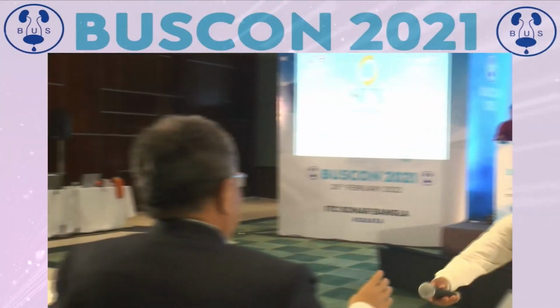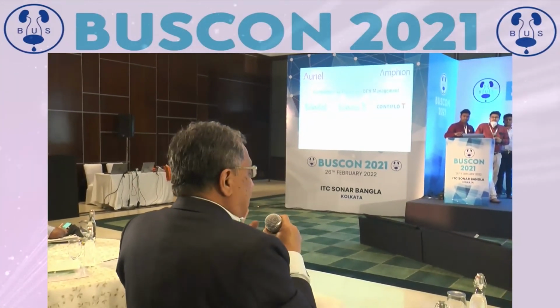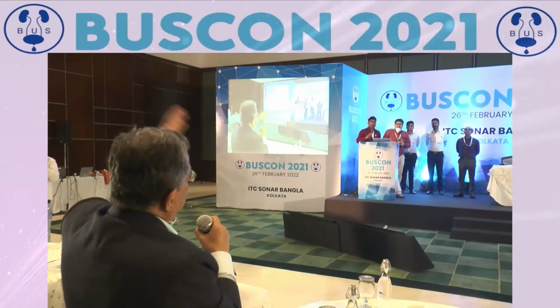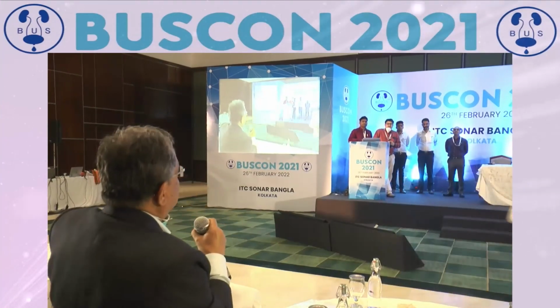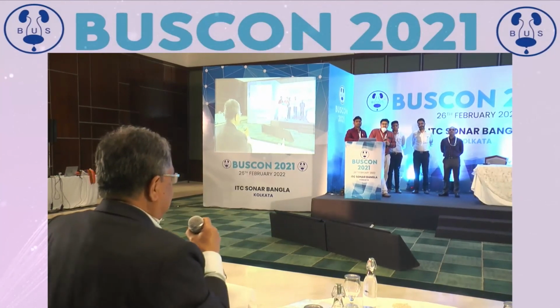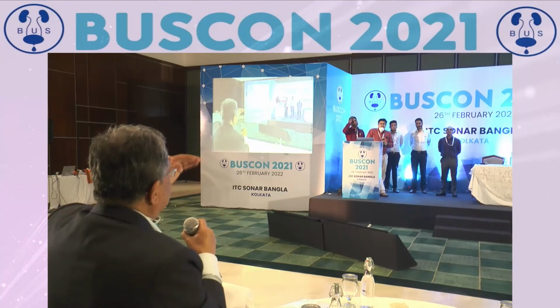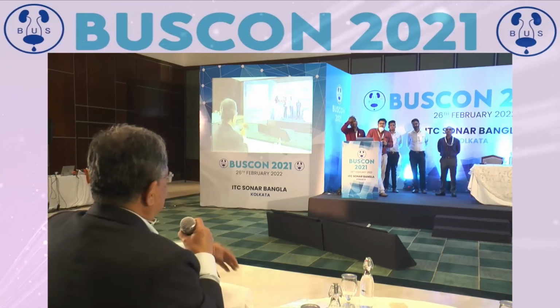Comment. No, I congratulate all the speakers for an excellent presentations. Here, the debate is on two levels. One is open versus endoscopic, and that's a long-standing debate. And there's no issue that endoscopic maneuvers will allow for easier patient recovery, and so that is one level of the debate. The other level of the debate is open enucleation versus endoscopic enucleation.